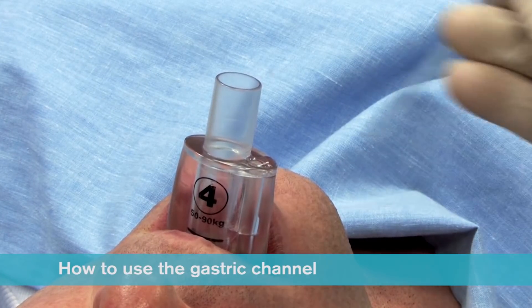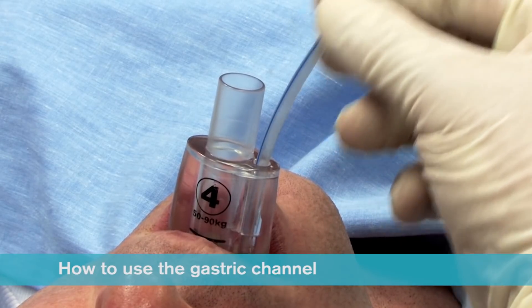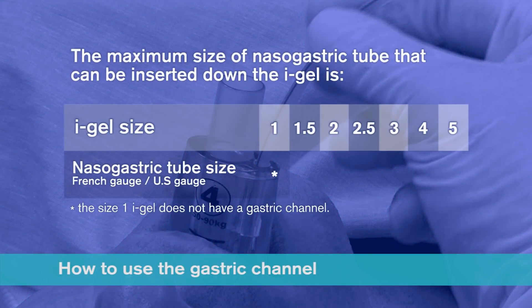The nasogastric tube should then be inserted a short way down the channel and moved in and out to prime it before completing insertion. The maximum size of nasogastric tube that can be inserted down the iGel is size 10 French gauge for a size 1.5, 12 French gauge for a size 2, 2.5, 3 and 4, and a size 14 French gauge for a size 5 iGel.